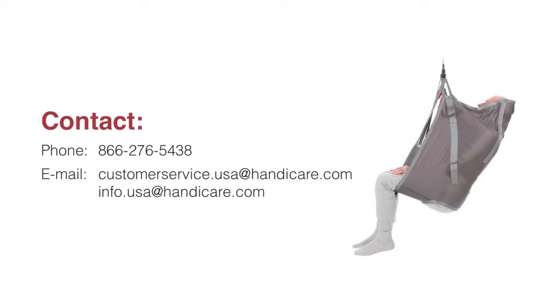Taking the time to learn and remember these simple procedures will pay off in years of safe and comfortable lifting for you and those you care for.